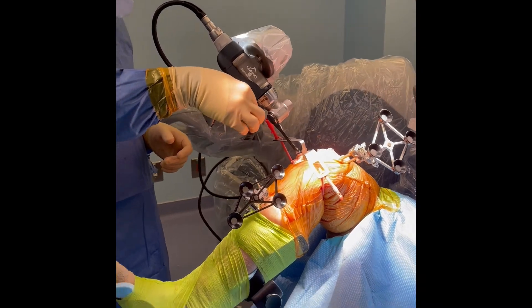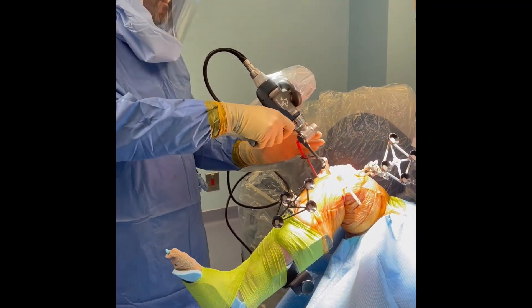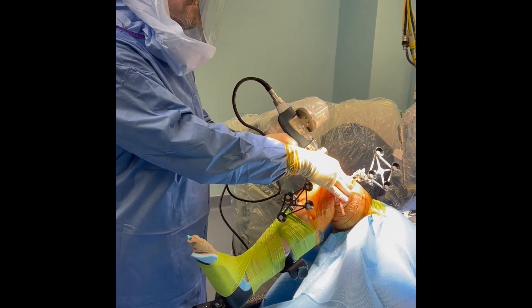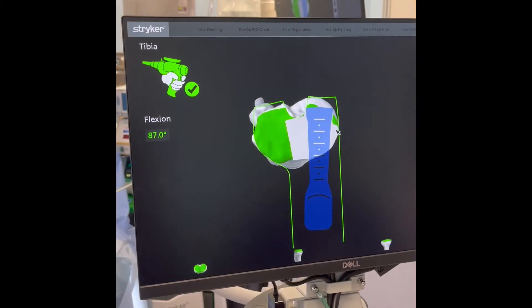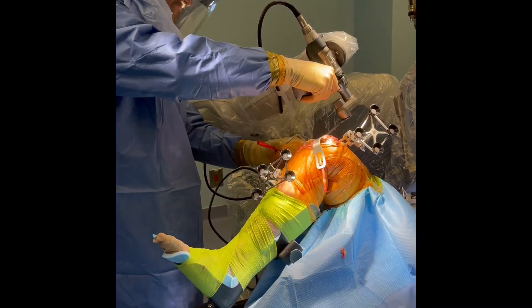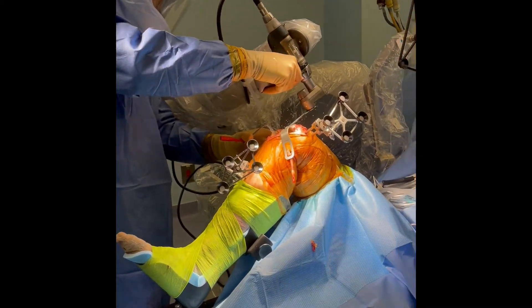Once everything is ready, the robotic arm moves the blade into place and you make the cuts with much better accuracy than I've ever been able to do before, while viewing it all on the screen. Here's another example — we'll show you more of this later, but that gives you a precursor.